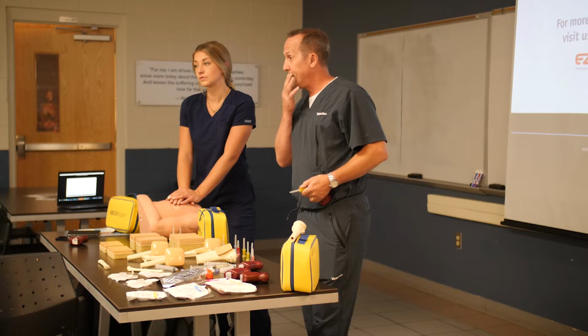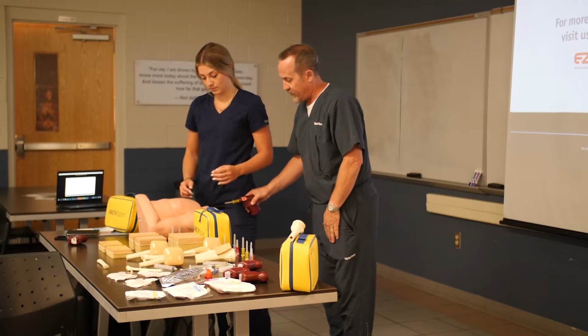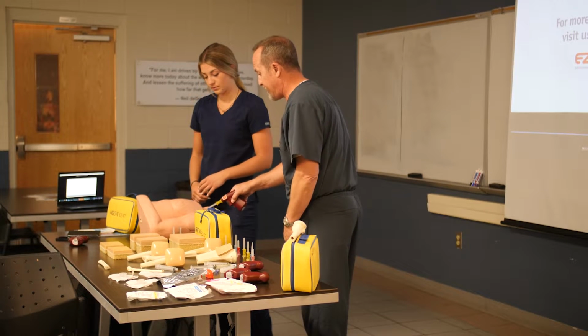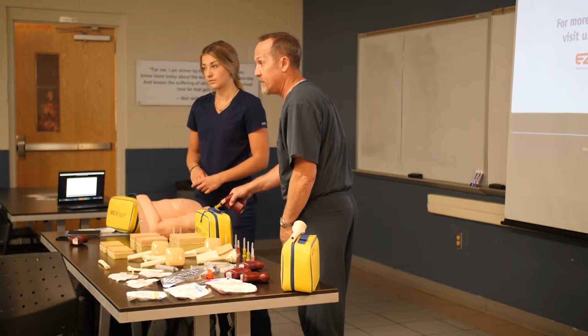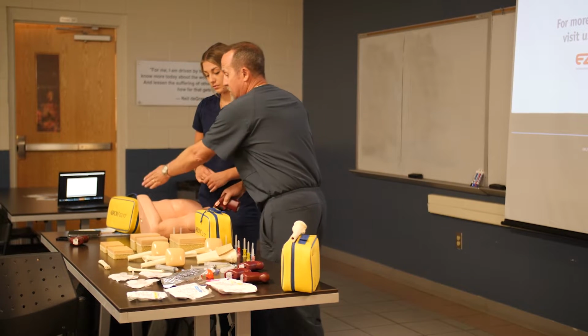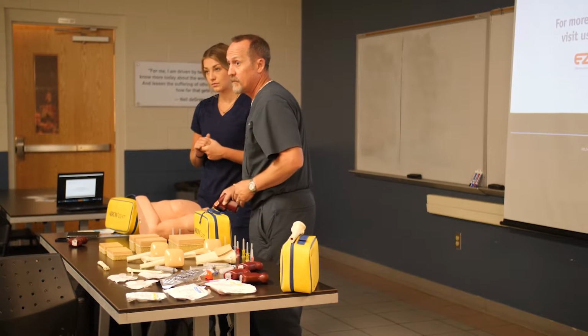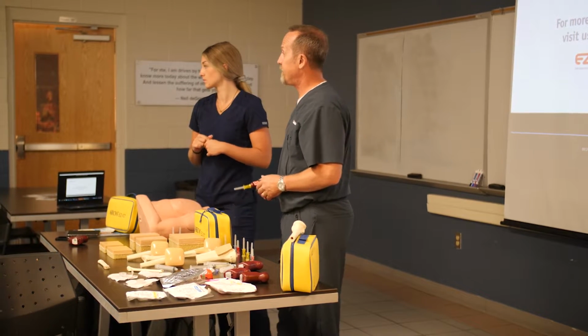The last 45, that was from the side, inside forward. So if we look at this little guy, I'm gonna go 45 degrees from the head, and then about 45 degrees from the bed. Does that make sense to everybody? So we're going anterior to posterior, in that imaginary seatbelt line. Any questions on any of that?